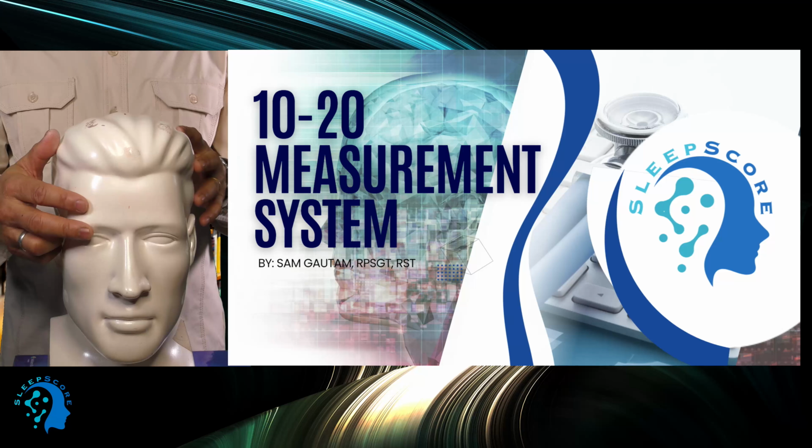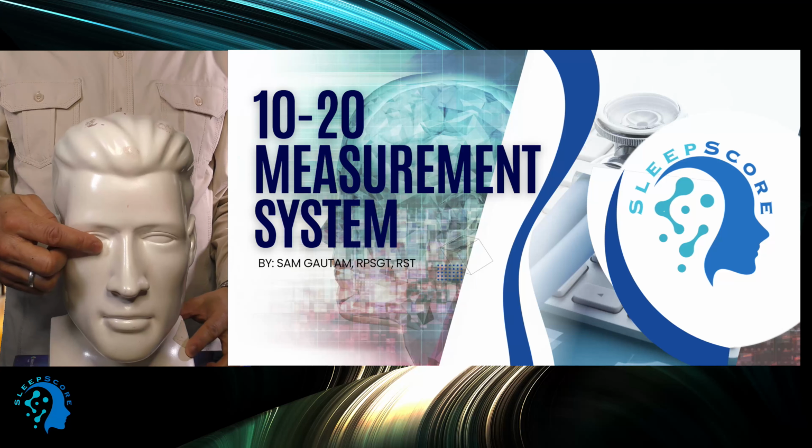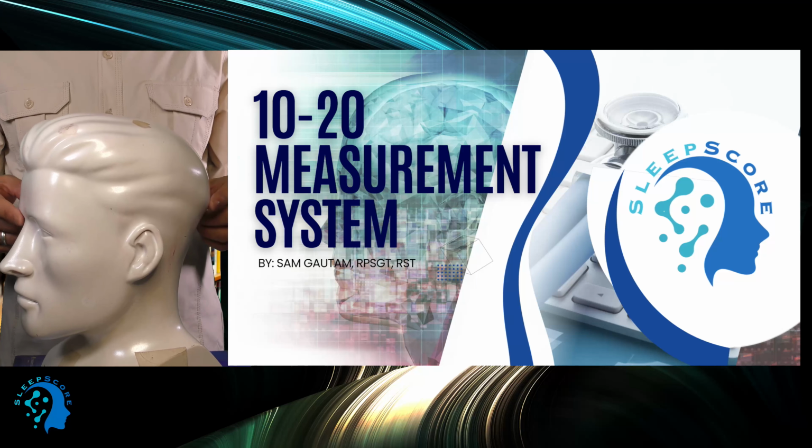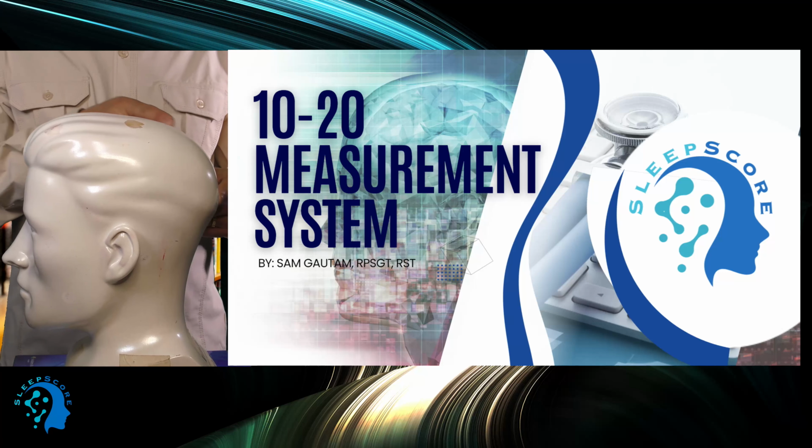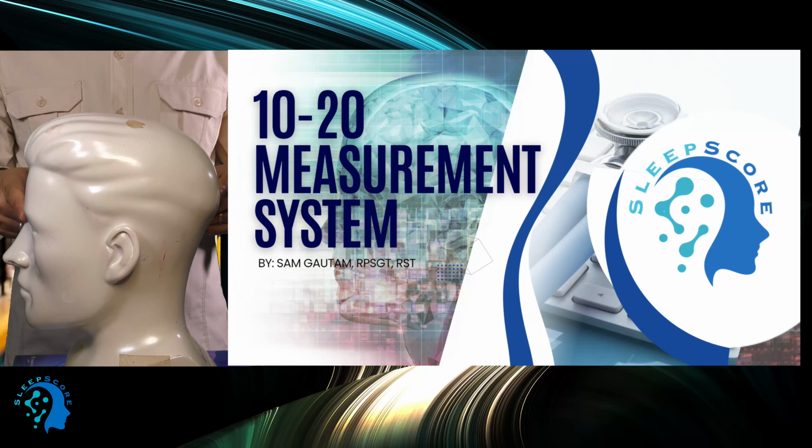Now, yesterday I told you about how to check. This is Nasion, and the other side, this one is Inion. Okay, this is Nasion and this is Inion. Now we have to measure this one. This is called the z-axis.